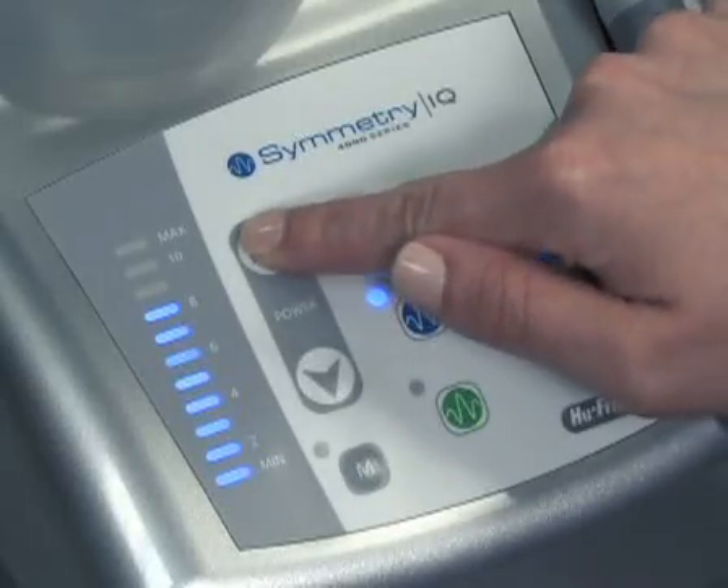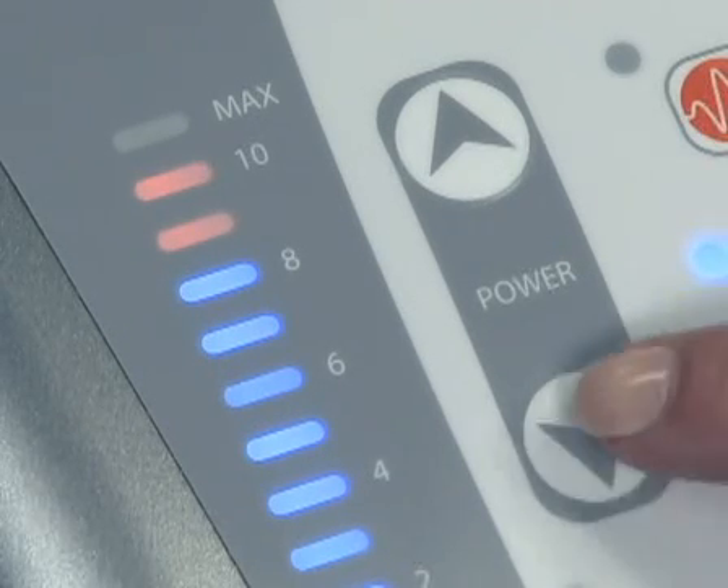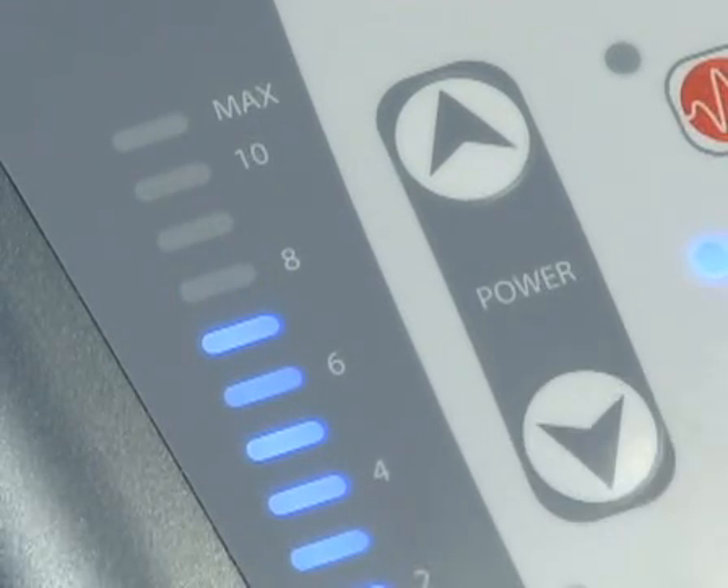Continuous pushing of the up arrow will cause the power level to increase. Likewise, continuous pushing of the down arrow will decrease the power level.